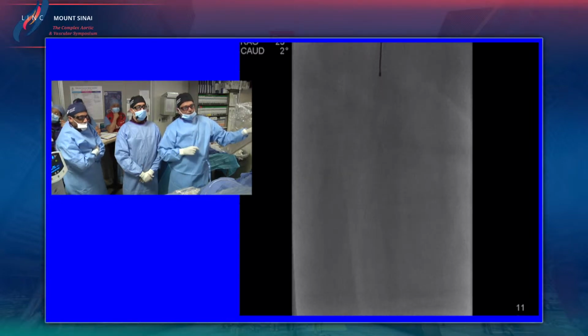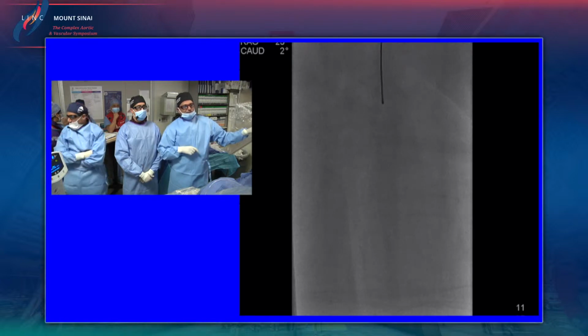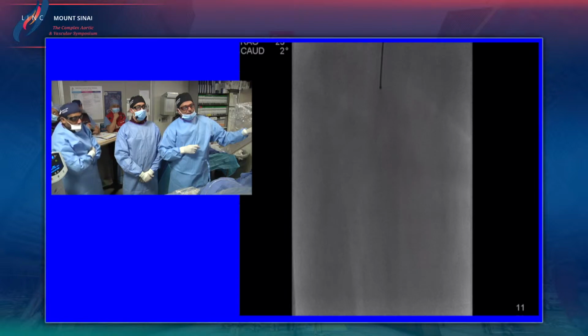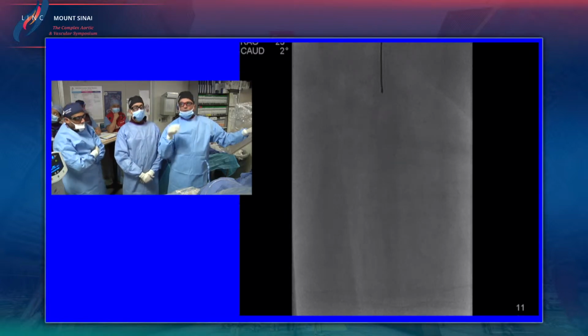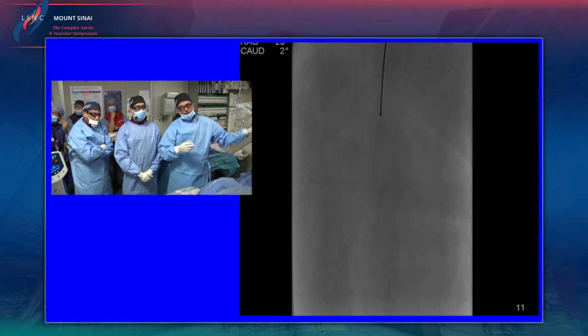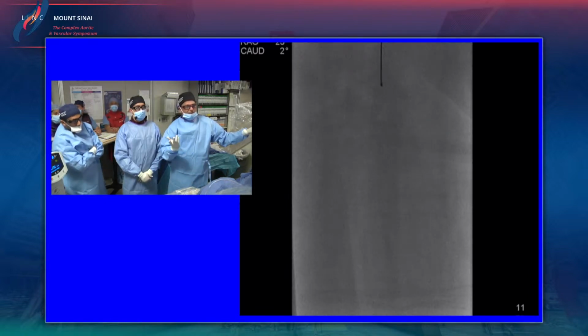I don't know if Dr. Wiley spoke about it, the fenestration catheter that tries to find the channels. And we didn't want to get underneath the actual stent because that was their mode of failure. They actually got underneath the Supera stent and couldn't re-enter. They could have either stuck it or not, but they didn't do that.